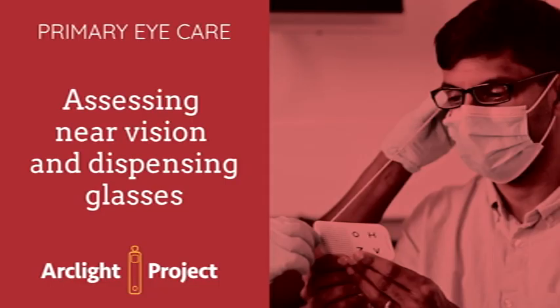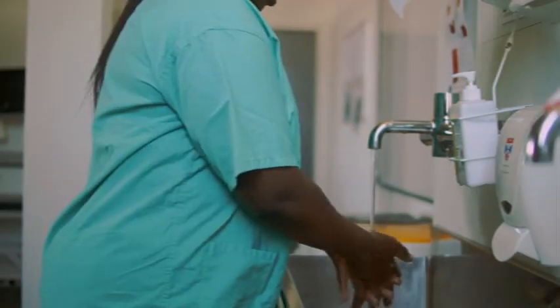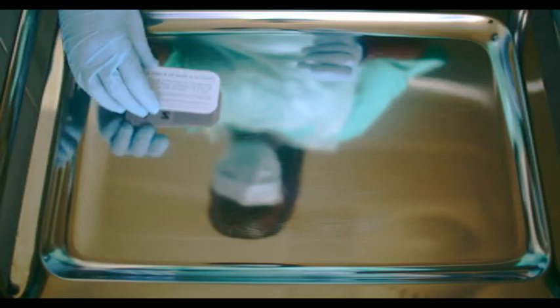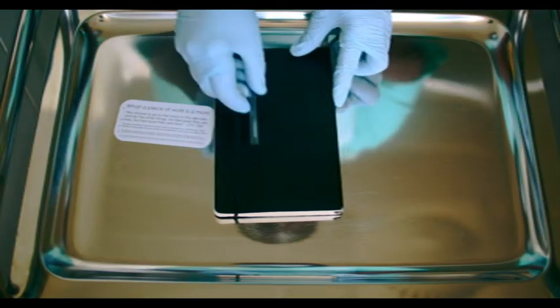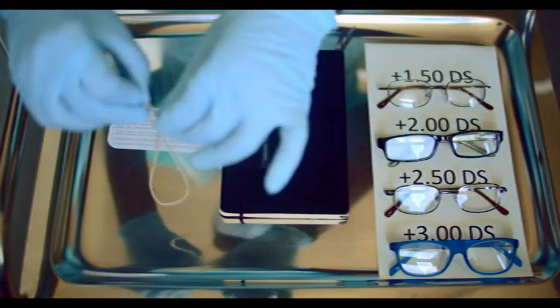This video demonstrates how to assess near vision and dispense glasses. Wash your hands and don PPE. You will need a near vision chart, pen and clinical notes, a range of reading glasses, and a 40cm long piece of string.